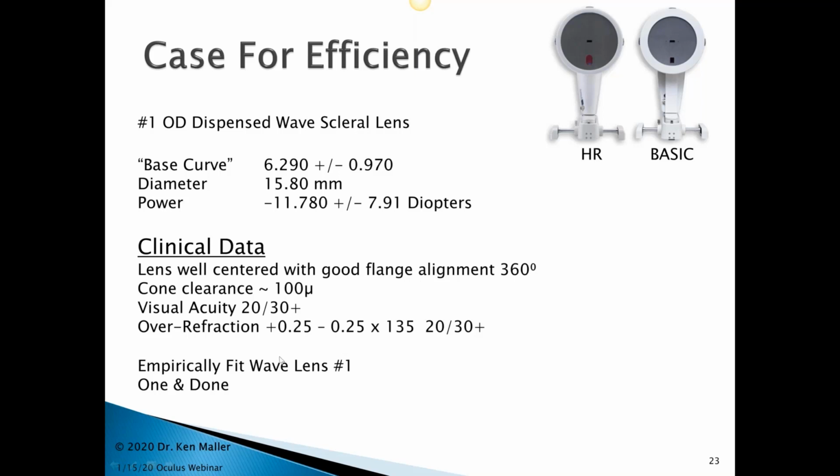I dispensed that lens. This gentleman actually was in earlier this week, which is about 7 weeks after I dispensed this lens. He's had about a 25 diopter shift in his cornea in topography. I didn't have a chance to include that in this lecture, but that's how his cornea has started to recover now that it's been under the scleral lens for the last 7 weeks. He has maintained very good vision through all of that, and he's very, very comfortable. He's doing very well with it.